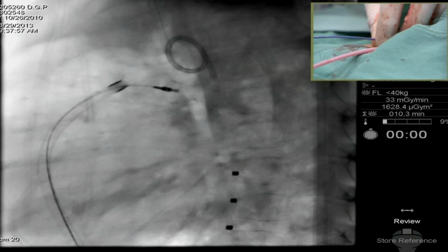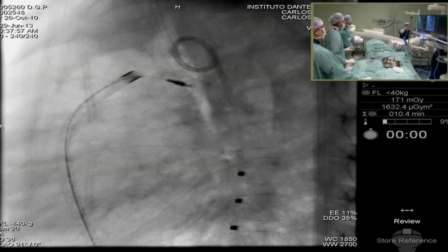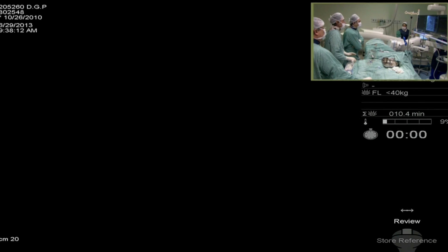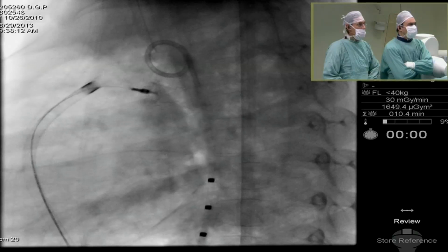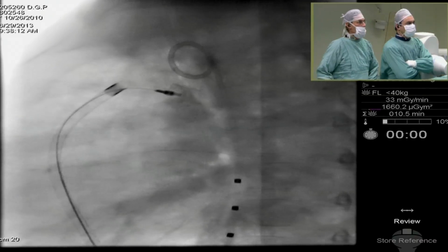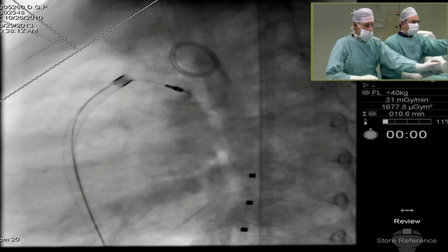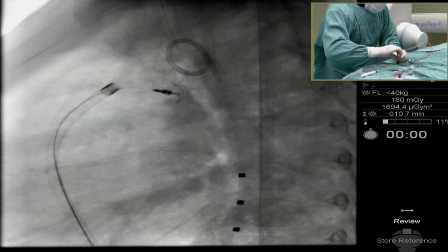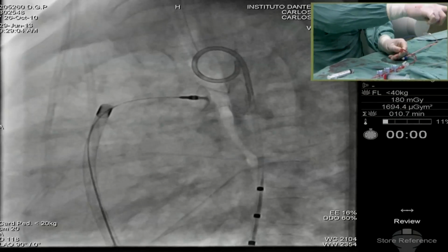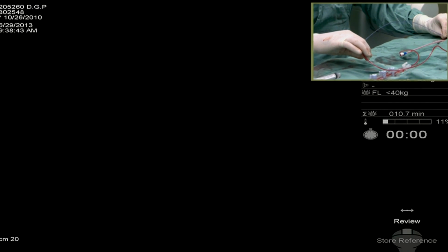Yeah. It does have some nice pinching. Let me see. No. Carlos, I don't know whether you want to change the pigtail to NIH or some other catheter so that you can do pullbacks without having to fiddle around with guide wires. Yeah, maybe. Let's take another picture here before release of the device. One other advantage I see of this device is that the screw is actually sticking out of the device rather than like the ADO1. Yeah, damn right. So this would be easier to snare.